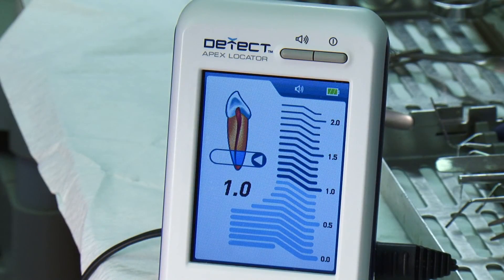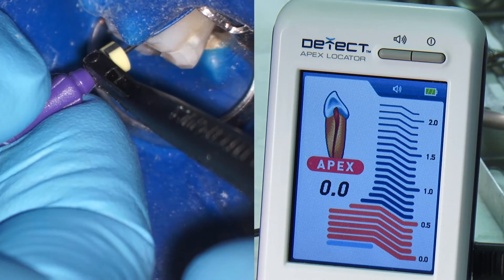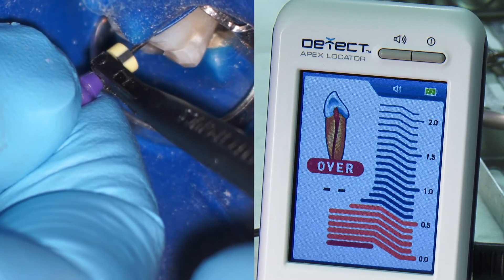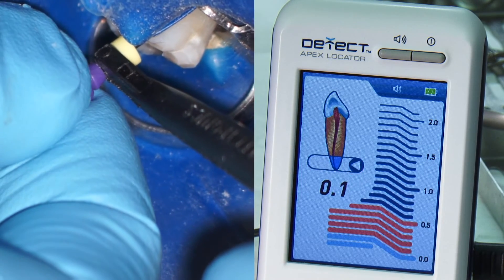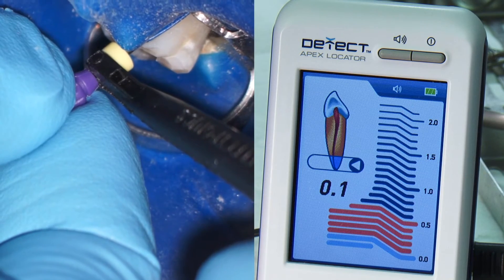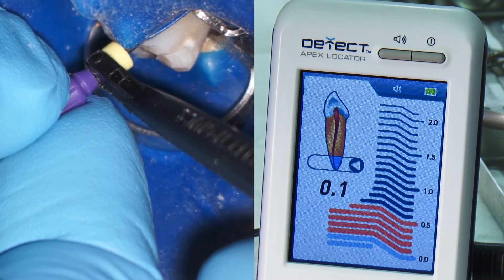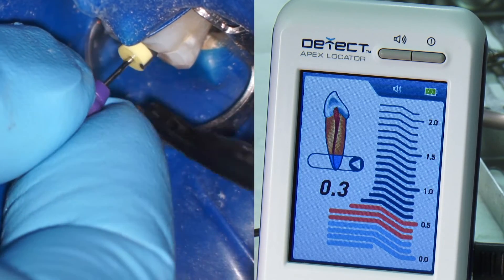The big screen clearly shows me where I'm at as I carefully negotiate the canal. I always go very slowly through the initial signal. When you're confident that you're in the neighborhood of the apex, slowly back the file out. Now you're fine-tuning your apical measurement, working back and forth, watching the screen, listening for the audio cues. When you're satisfied that you've zeroed in on the apex, set your rubber stopper, pull out the file, and then record your length. I'll do it twice, then I'll move on to the next canal.